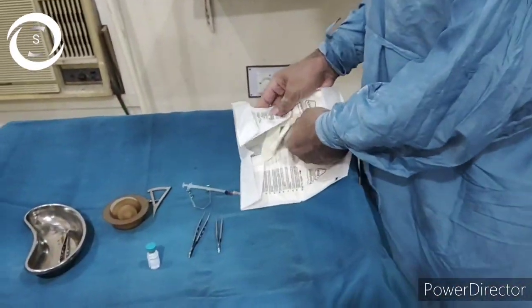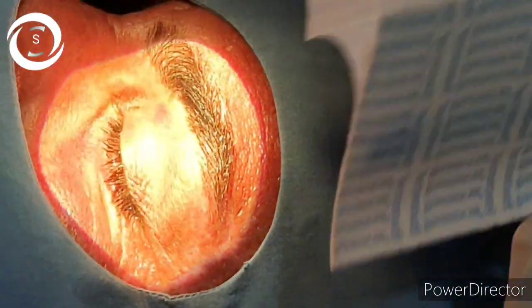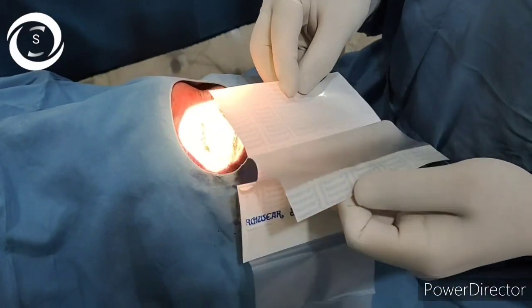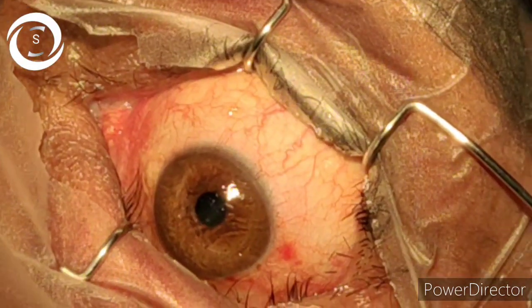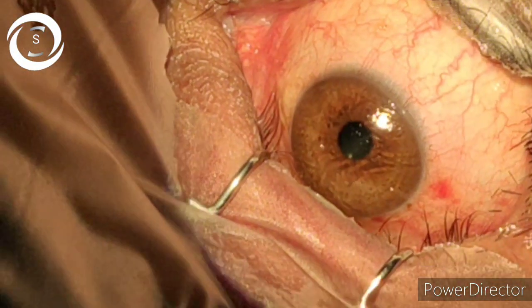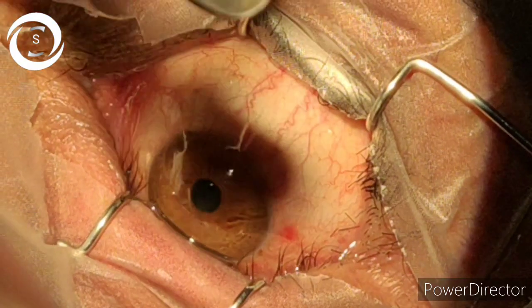Then identify the status of the eye, whether it is phakic, pseudophakic or aphakic, because then you have to mark the pars plana. In phakic it is 4 millimeter from the limbus, in pseudophakic 3.5 millimeter from the limbus, and in aphakic 3 millimeter from the limbus.